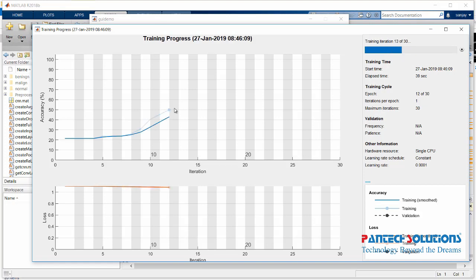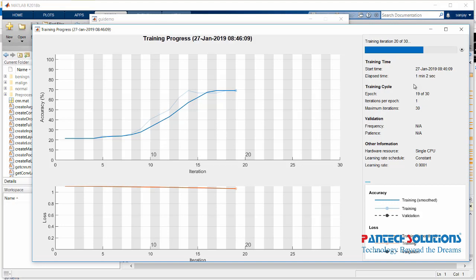The loss is decreasing and the accuracy is increasing. In order to get more accuracy, you have to increase the epochs.